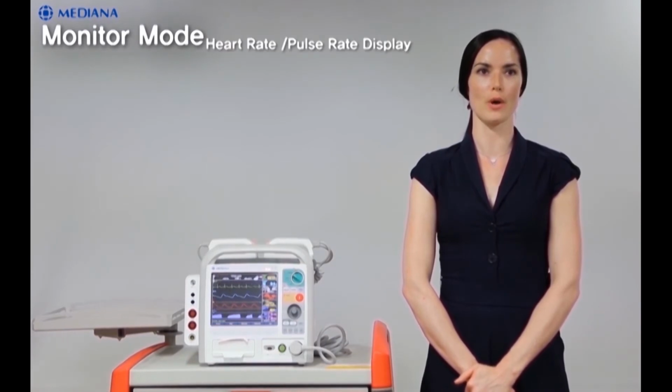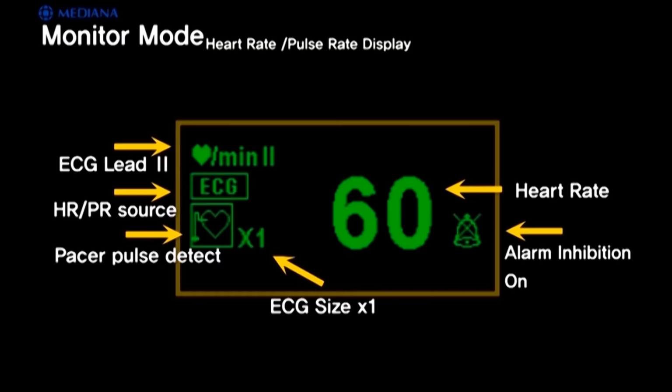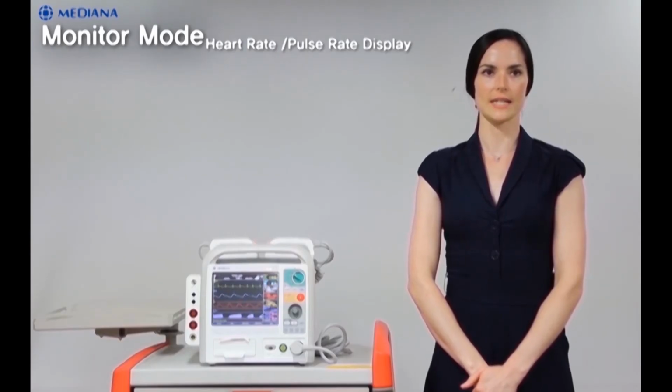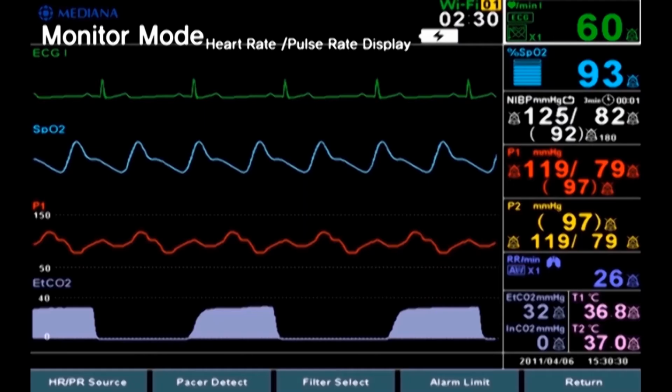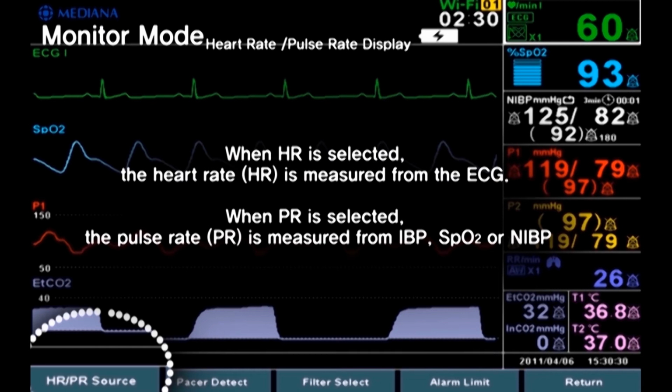Next, we have the heart rate, pulse rate display function. The calculated heart rate, pulse rate may be derived from different sources: ECG, SpO2, NIBP, or IBP, as shown by the icon in the HR/PR numerical area. Let's take a look at the heart rate, pulse rate menu. Number 1, HR/PR source. Auto HR/PR can be chosen for HR/PR source. When HR is selected, the heart rate is measured from the ECG. When PR is selected, the pulse rate is measured from IBP, SpO2, or NIBP.